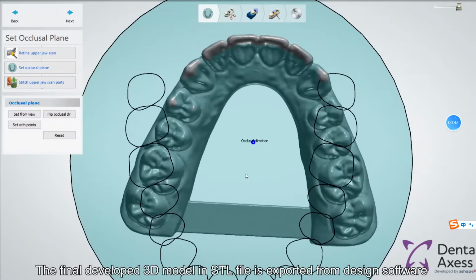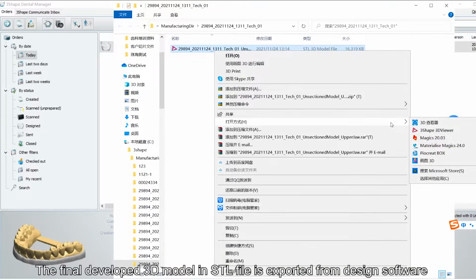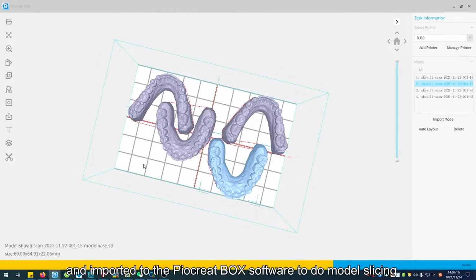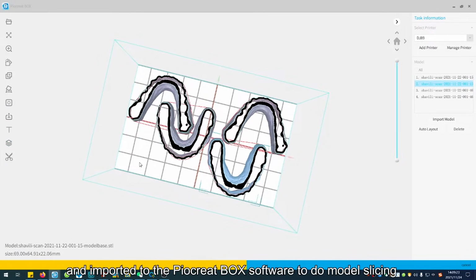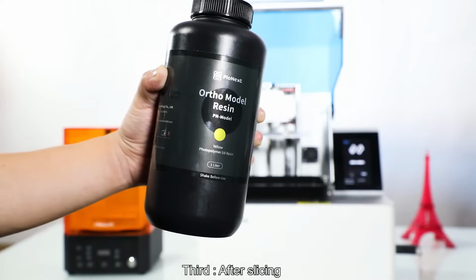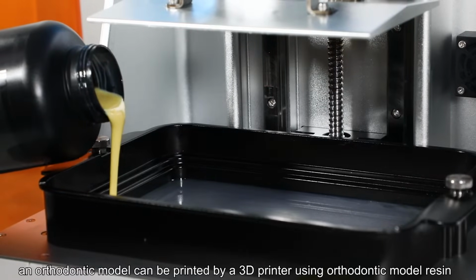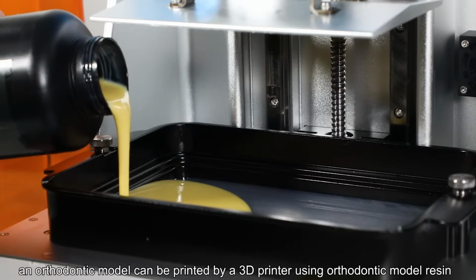The final developed 3D model in STL file is exported from the design software and imported to the Piocreat BOX software to do model slicing. Third, after slicing, an orthodontic model can be printed by a 3D printer using orthodontic model resin.